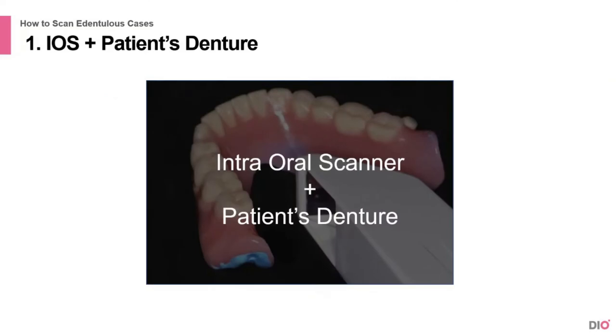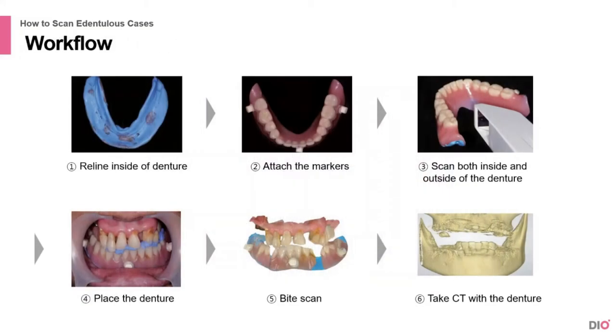First of all, we are going to learn how to scan the patient's denture with an intraoral scanner. If there's an intraoral scanner and a fabricated denture model in the dental clinic, you can get the oral scan data with the patient's denture.